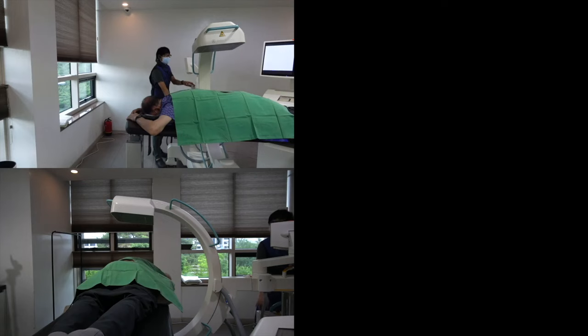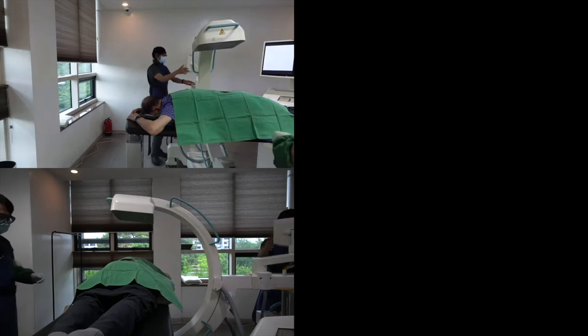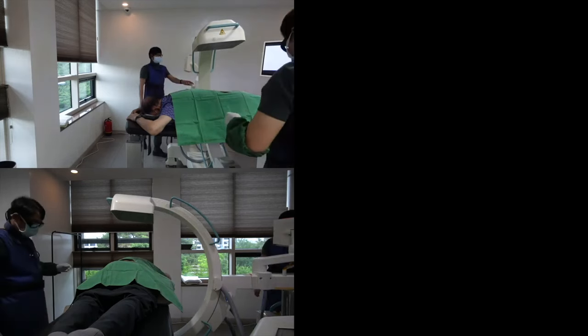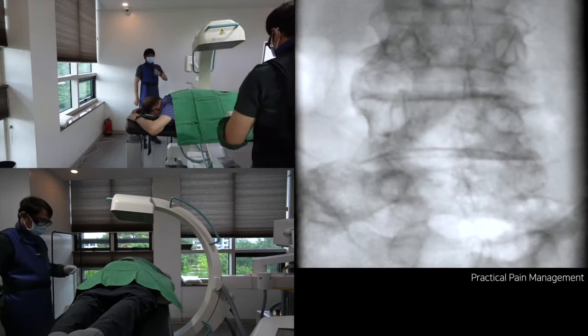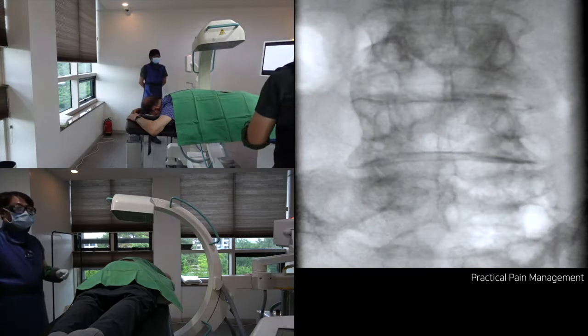It is one of the videos that show how much rotation and tilting I need to find a target and approach the needle. In this case, you will learn how to make an alternative approach when you fail to access the target of the facet joint. Maybe you will learn about being patient and steady. I will show you an inferior approach to the facet joint injections of both L4-5.